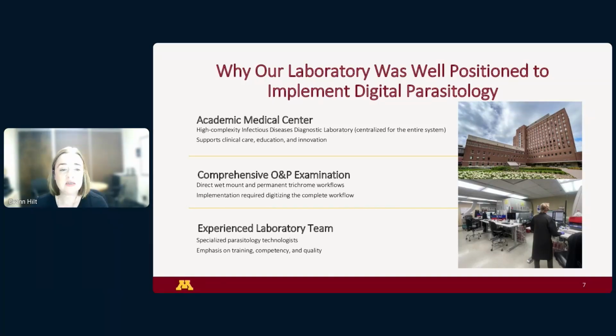We do the comprehensive ova and parasite exam, so both direct mount and permanent trichrome workflows, and it required digital. As we'll go into, we digitize this entire workflow, not just a simple piece of it. Plus, I've got to give it to my team, my lab staff. We have specialized parasitologists, and the entire lab is very motivated, always wanting to take on a new challenge and anything to help improve their day-to-day workflow. They wanted to take on the challenge, while emphasizing training, competency, and quality throughout this process.